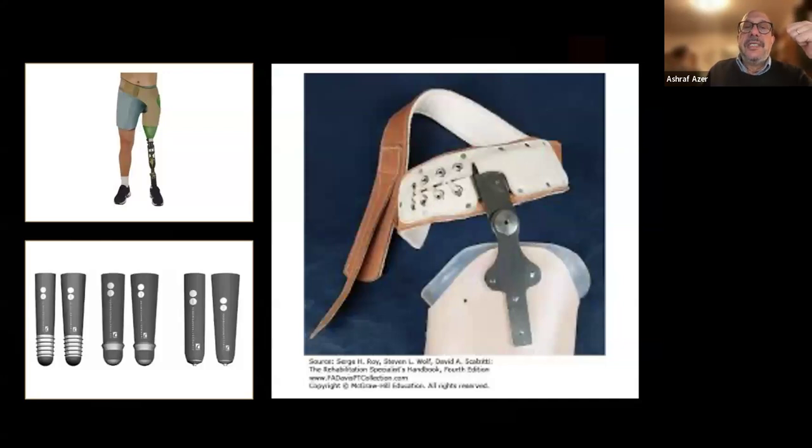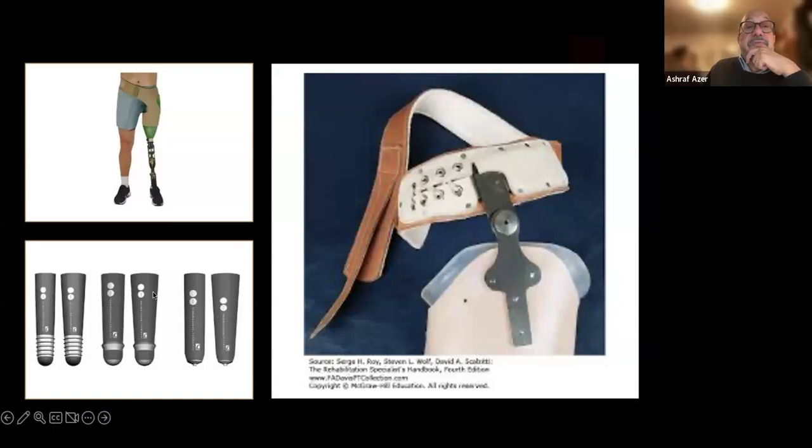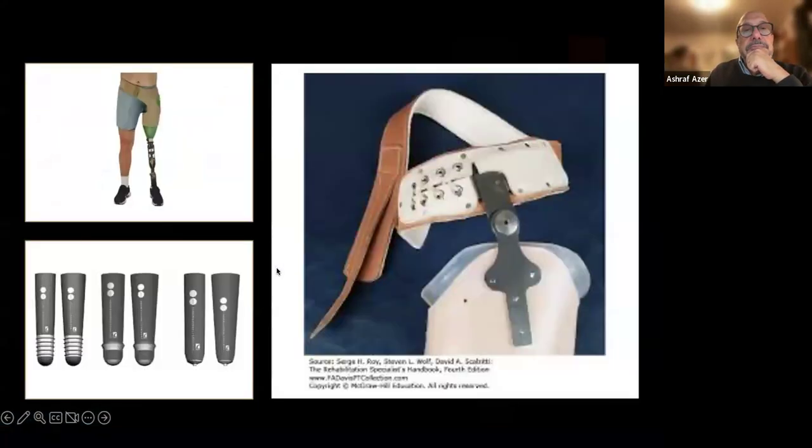So you commented on the suspension, Dr. Ashraf: it consists of the liner and the belt. Some people wear a liner only because they have good quads, sorry, good glutes, so we don't give them a belt. Okay. Why? This is a suction one. The patient wears this and because of the suction, I'll show you. You'll see here a valve. So he goes into that, expels air out, the valve will close and it will be completely attached to him. Okay? So he wouldn't need an auxiliary belt.